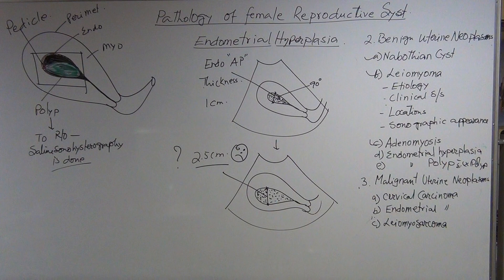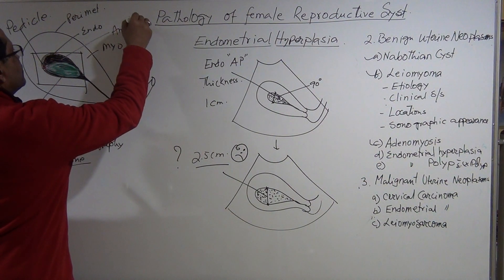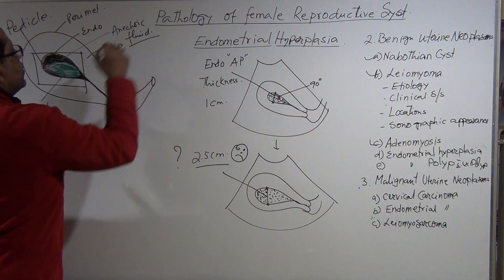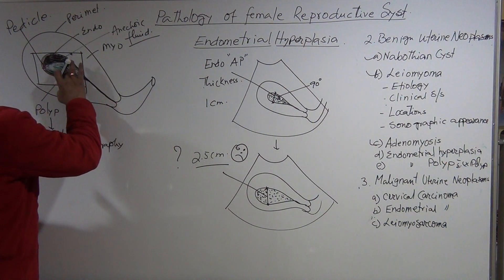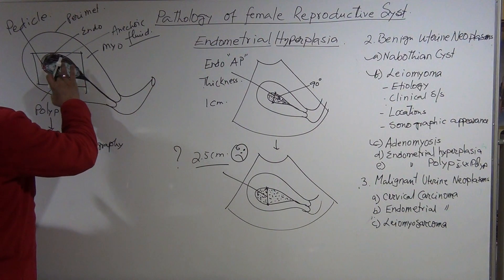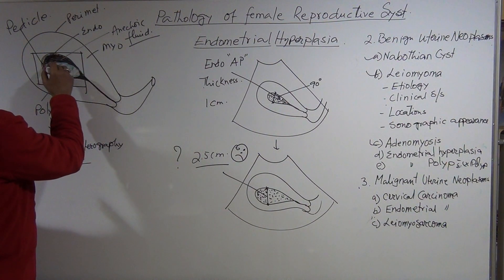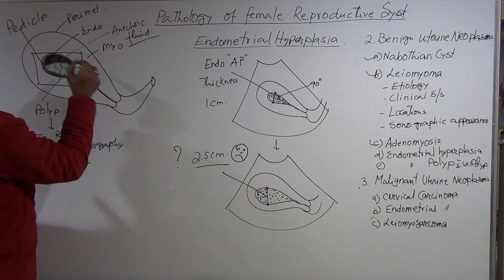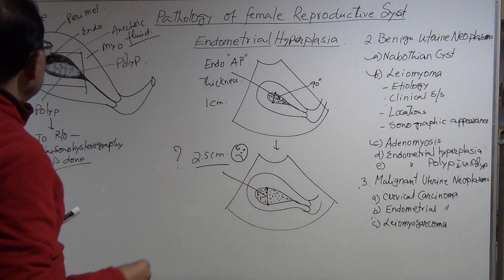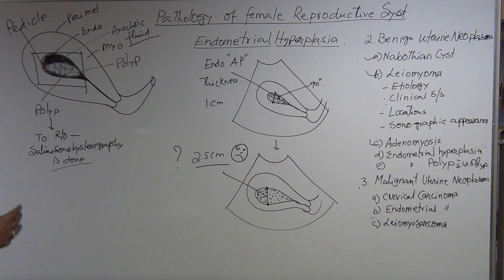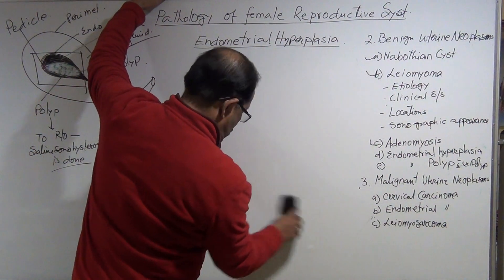Now you can see the polyp — this is the anechoic fluid, and this is the polyp. If it is not a polyp but a growth, then the growth has no pedicle; it has a wide base attached with the endometrium.